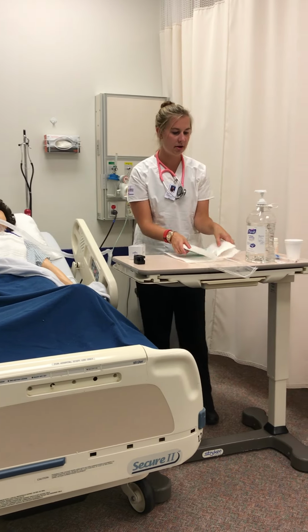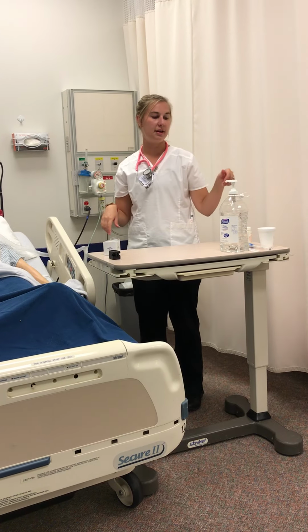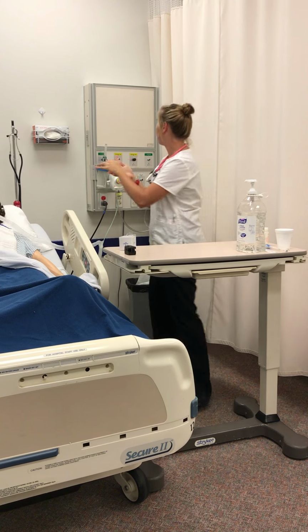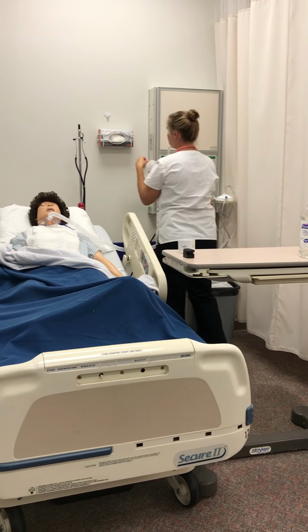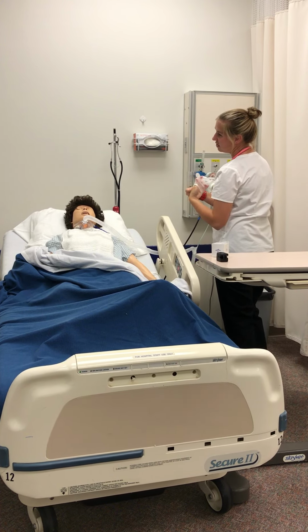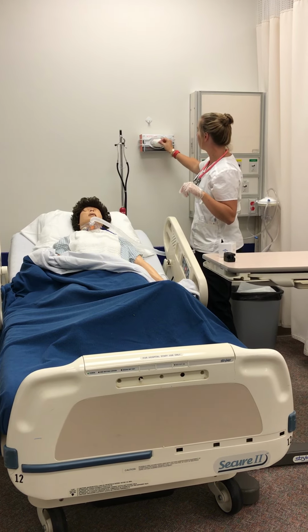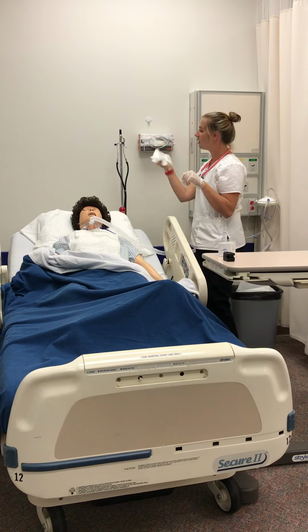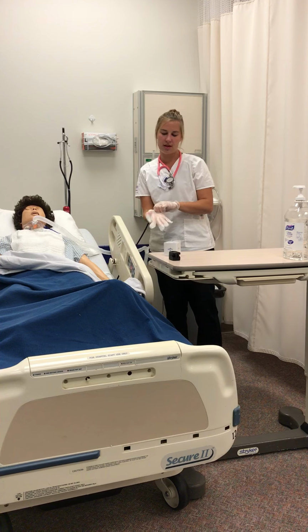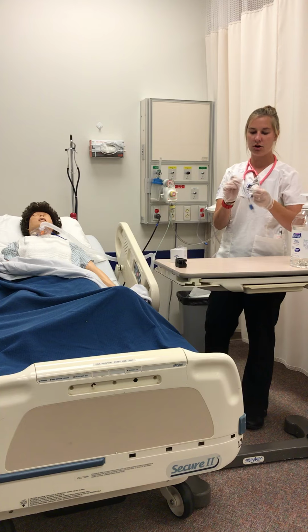All right. From here, I'm going to remove the sterile field. I'm going to keep the saline solution out. All right, Gretchen, since you did a bit of coughing, I'm going to use a sponge swab to clear out those secretions from your mouth, okay? Swabbing the mouth after trach suctioning makes sure that pneumonia is reduced, or the risk for pneumonia.